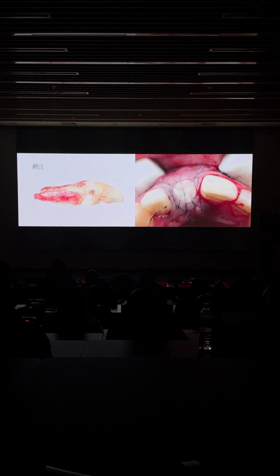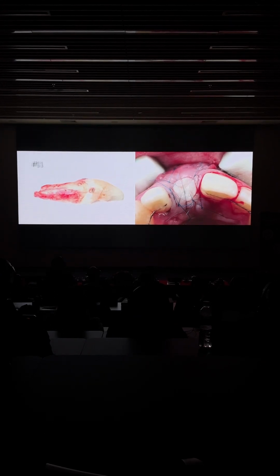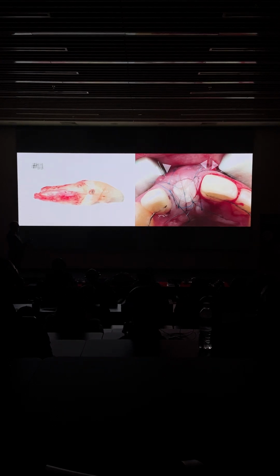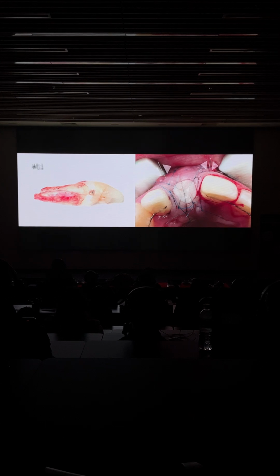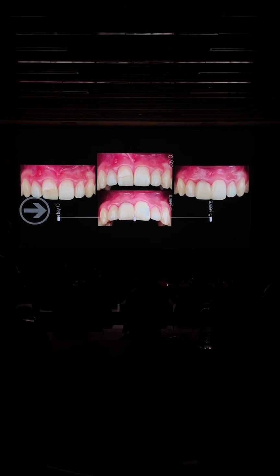This is another case. Going back to the case I started, you can see all the fractures, the apicoectomy, how bad this tooth was, and we never elevate the flap. It's a flapless procedure, and as I showed you yesterday, we make some vertical openings, small openings just to tag our membrane and graft the site. So this is where we started. This is 5 years down the road. We use the same tooth as a provisional restoration.